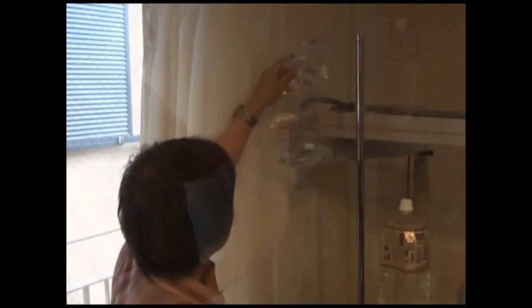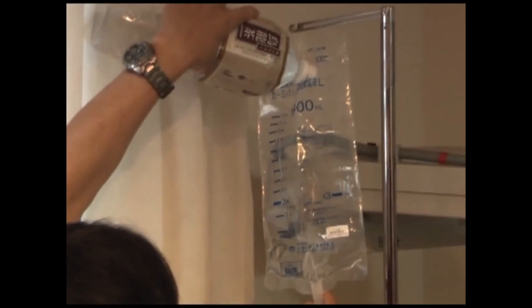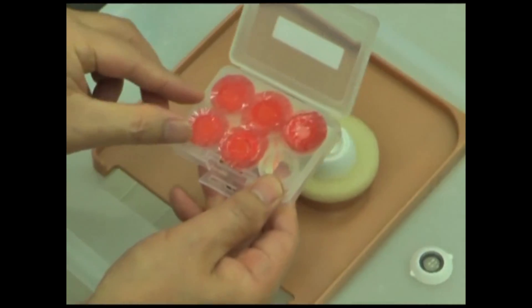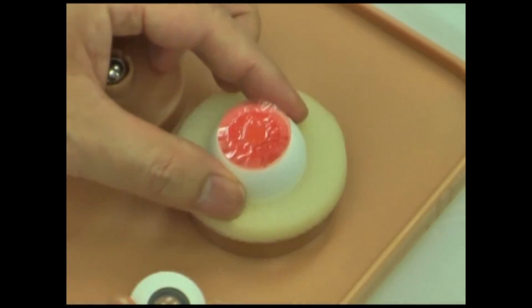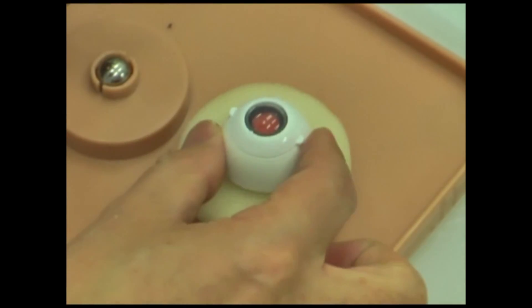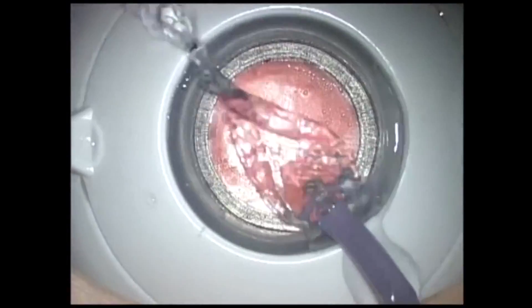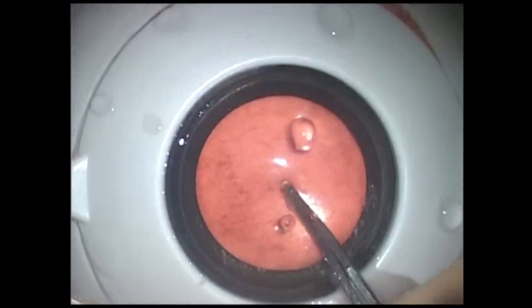The setting: put tap water into the irrigation bag and connect it with the irrigation line of the phaco machine. Prepare a drainage box or some other drainage system and place the Kitaro on it. Take one artificial cataract lens from the five-piece pack and set it in the hollow of the sclera part. Set the cornea iris part in the sclera part and cover it with a mask. Make side port incisions and a corneal incision. Fill the anterior chamber with viscoelastic. If you want to reduce the amount of viscoelastic, fill another chamber with water and put a small amount of viscoelastic on the anterior capsule.